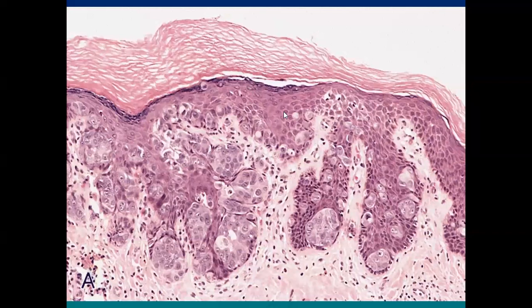In this image, you find lots of abnormal cells which are present in groups, small and larger groups, infiltrating this epidermis, and these groups are very different from the usual keratinocytes which are present in the epidermis. So this is called the Pagetoid spread, and this is Paget's disease.